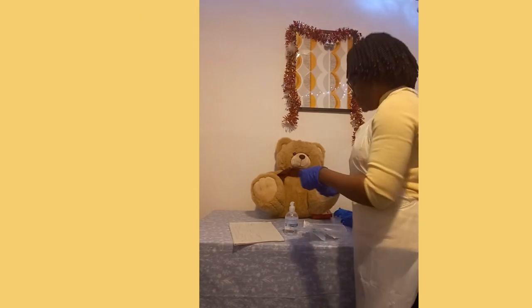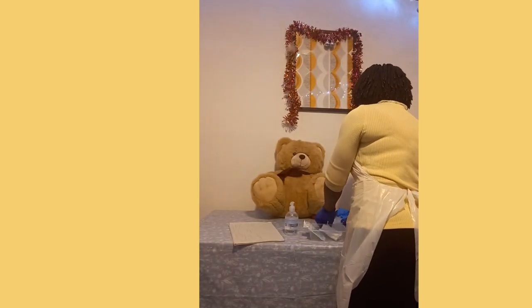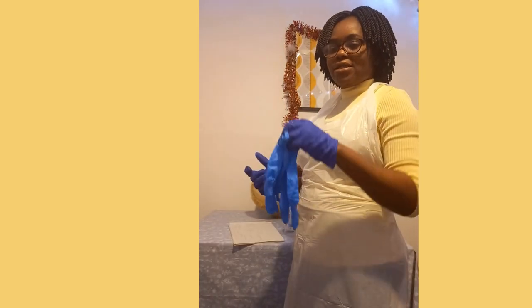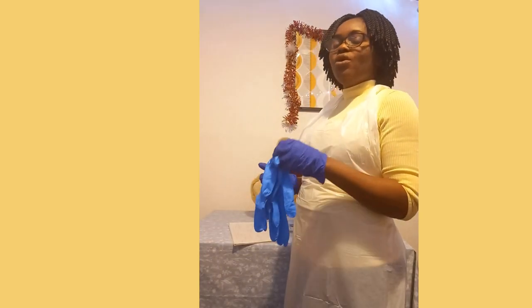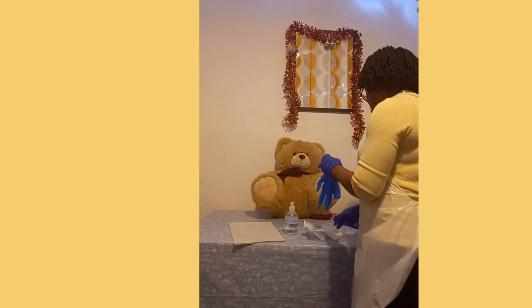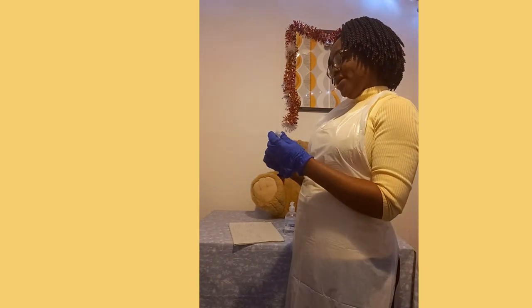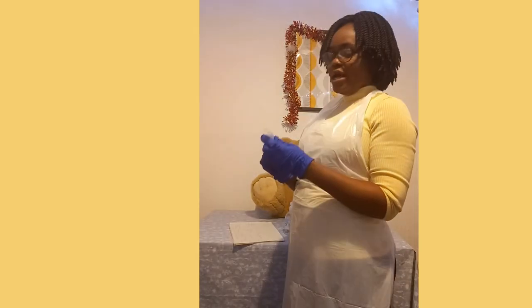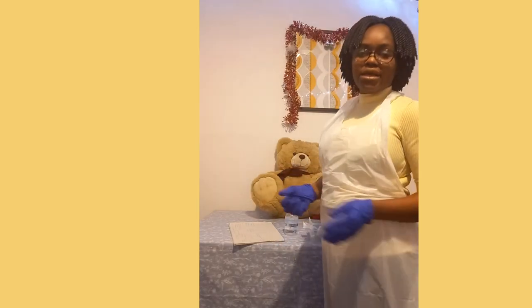I'm going to need two pieces of gauze — intact and in date. And I'm going to need a pair of gloves. It is advisable to put more than one pair of gloves in your tray in case one falls on the floor and can't be used, but for this demonstration I will go with one pair — intact and in date. I have with me my hydroxocobalamin injection 1 mg/mL — batch number 1234, expiry date April 2026. I'm happy to use it. I put it in my tray.